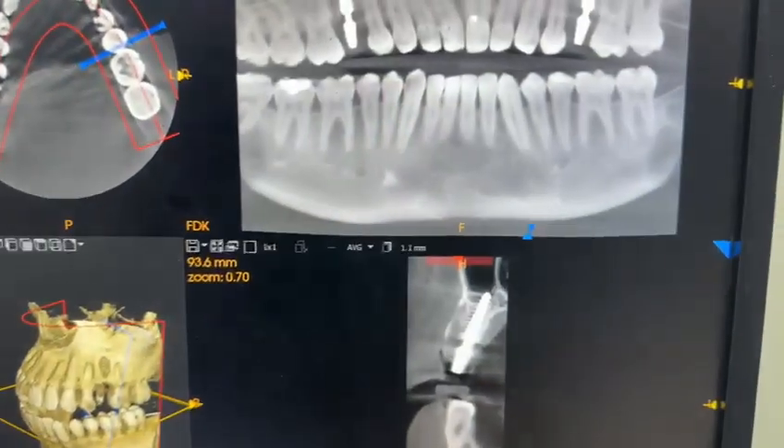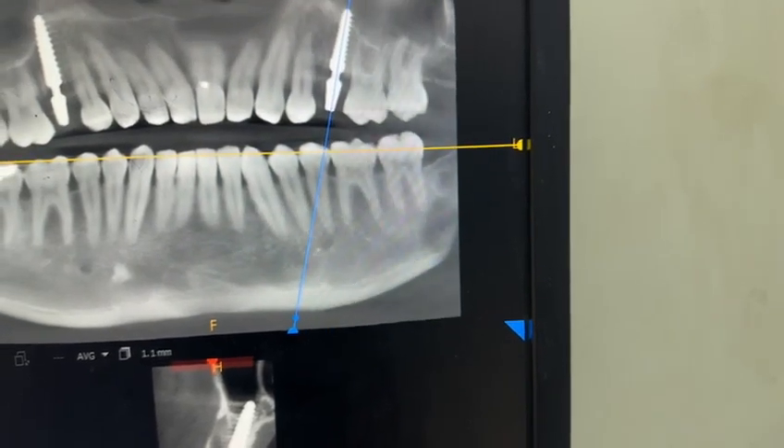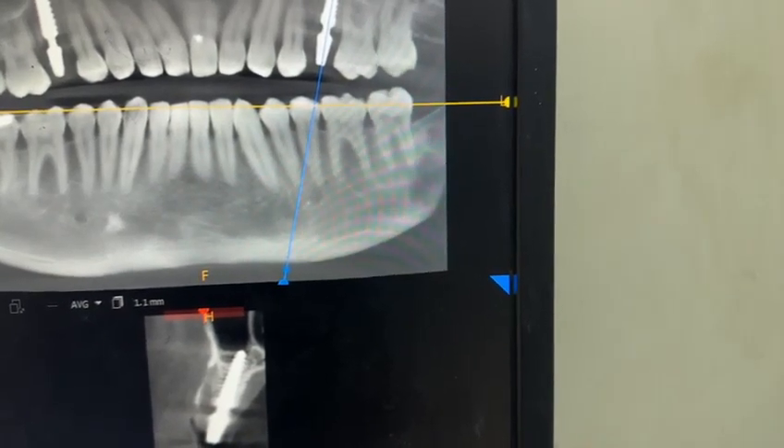In this patient we didn't have a pre-op CBCT. This is immediate extraction of both sides, second premolar, and placement of a Simpladent compressive implant, 4.1 and 15.